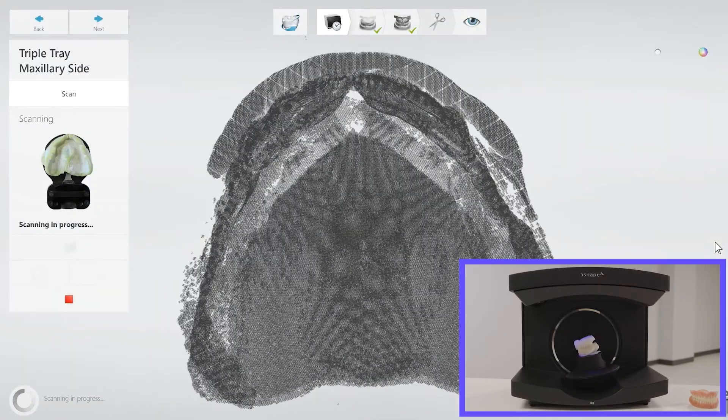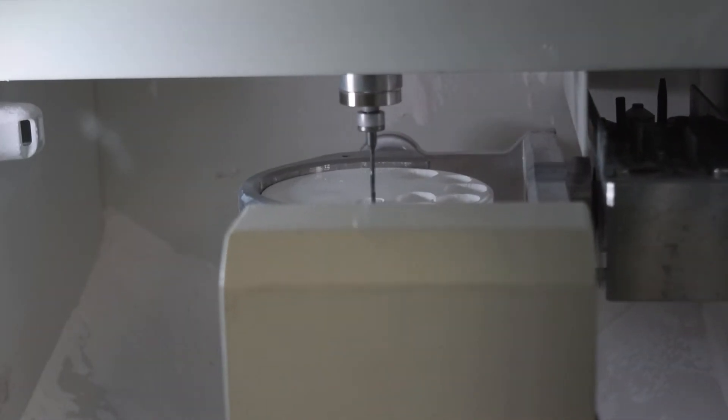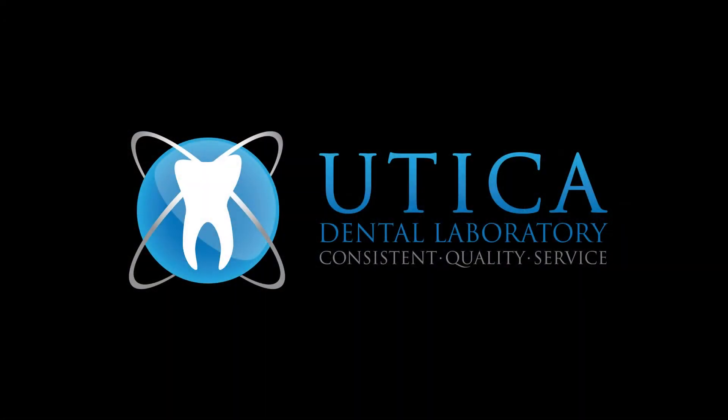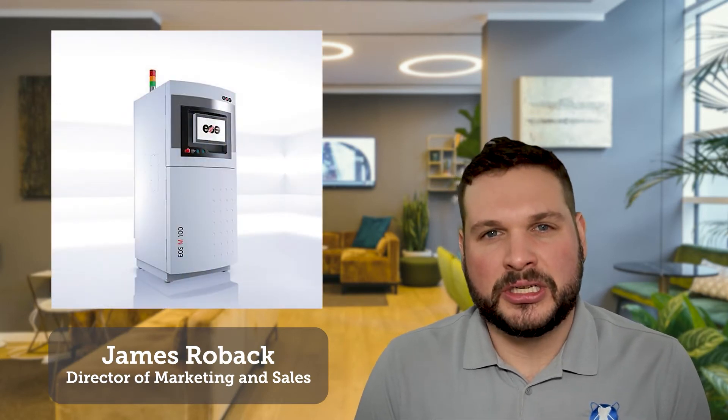Direct metal laser sintering — every now and again a technology comes along that renders the previous technology totally useless. 3D metal printing is one of those breakthroughs. Today we're going to focus on our 3D metal printed partial framework. About two years ago, Utica Dental Lab invested in an EOS M100 DMLS 3D metal printer. That technology has totally revamped our processing for our partial frames, and the procedure has completely superseded casting as a whole.